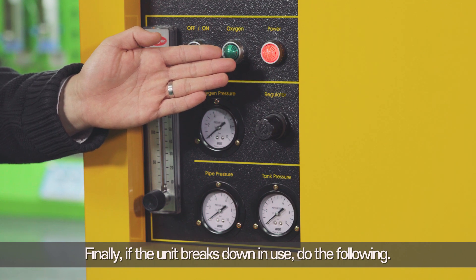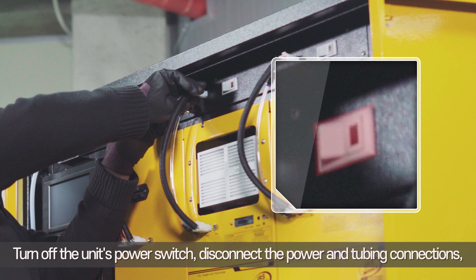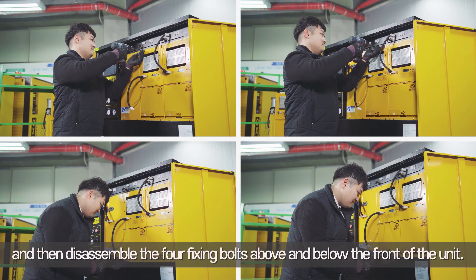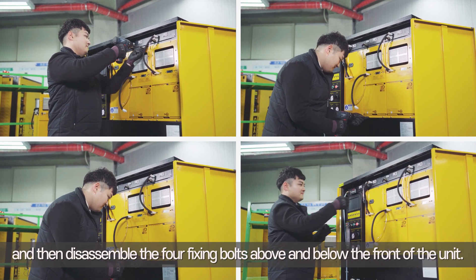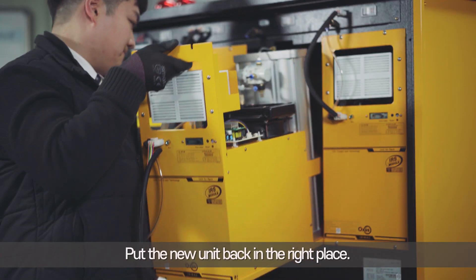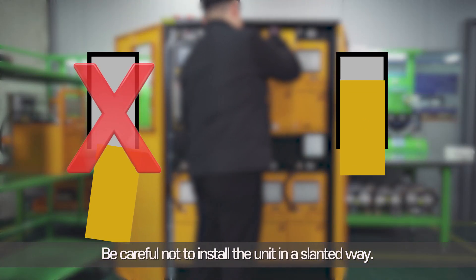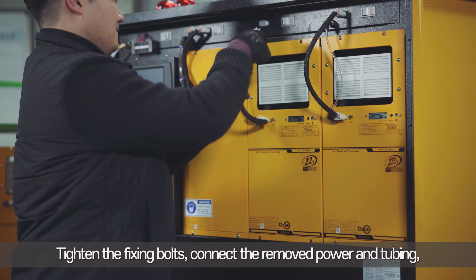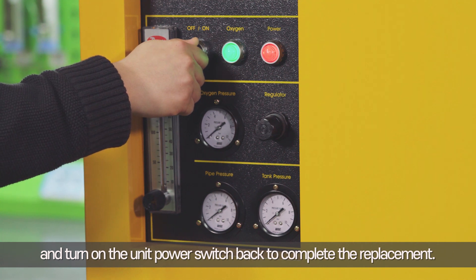Finally, if a unit breaks down in use, do the following: turn off the unit's power switch, disconnect the power and tubing connections, and then disassemble the four fixing bolts above and below the front of the unit. Pull the unit forward and it will come out. Put the new unit back in the right place, being careful not to install it in a slanted way. Tighten the fixing bolts, connect the removed power and tubing, and turn on the unit power switch to complete the replacement.